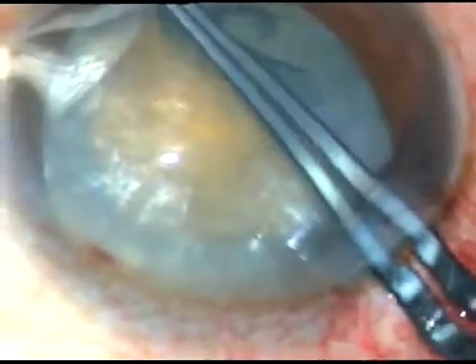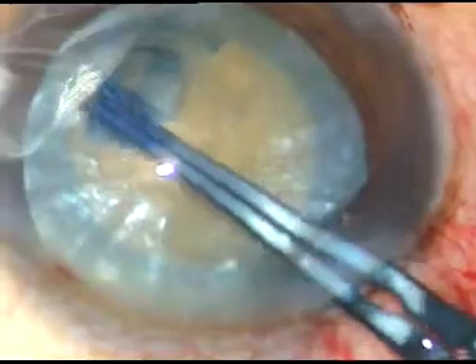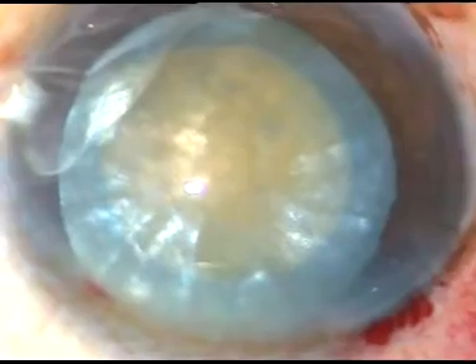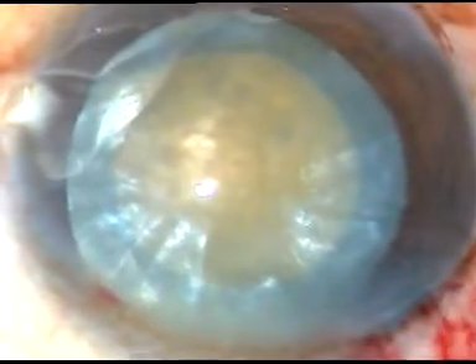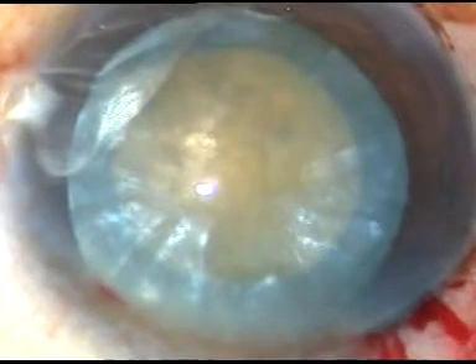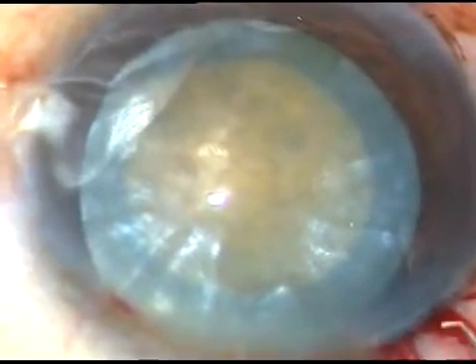This is my usual way of doing capsulorhexis in intumescent cataracts, and I am getting consistently beautiful results. In the last 10 years, I haven't found any Argentine flag sign.